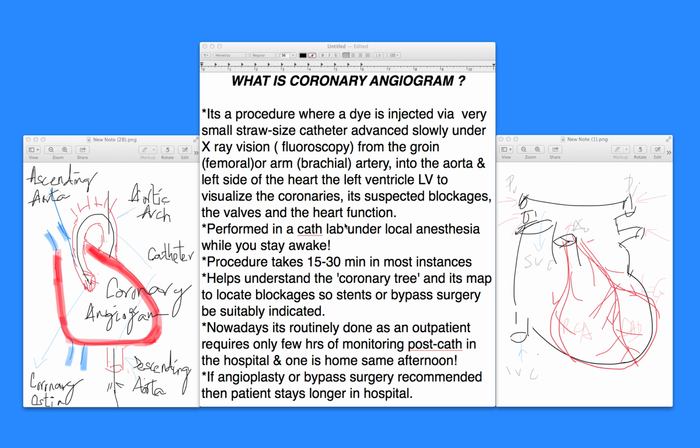This is Dr. Jaitly. In this section, I'll be talking to you very briefly about the fundamentals of answering a question: what is a coronary angiogram? Time and again, one has heard that, oh, my brother had it, my uncle was recommended, or my father had it, or you have been recommended to have a coronary angiogram. So obviously, that's a question that rings in mind. What is it? What does it entail? How does it help? And what does the procedure require of you, etc. So we'll try to answer some basic questions here.